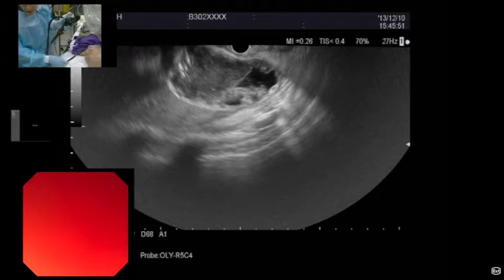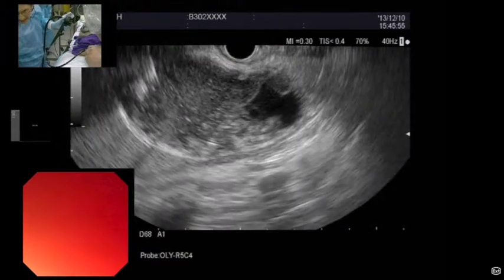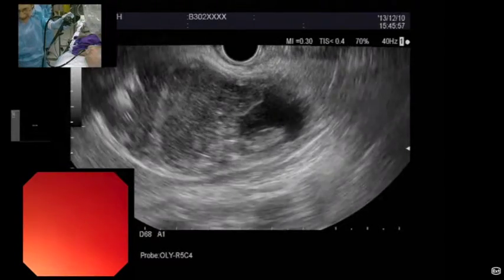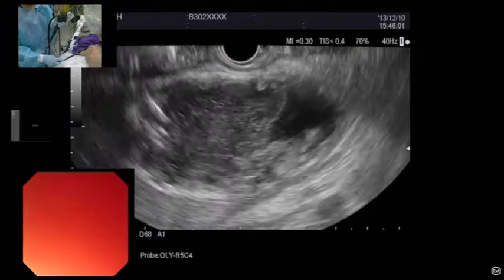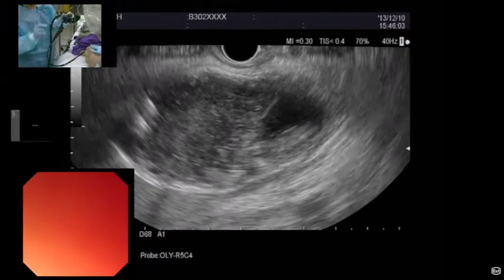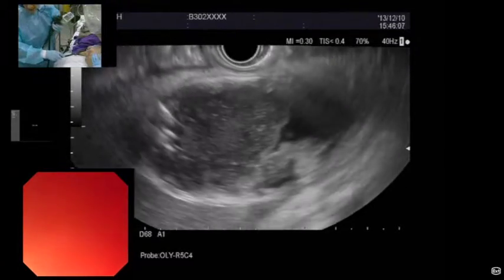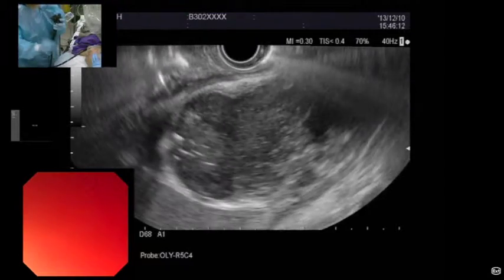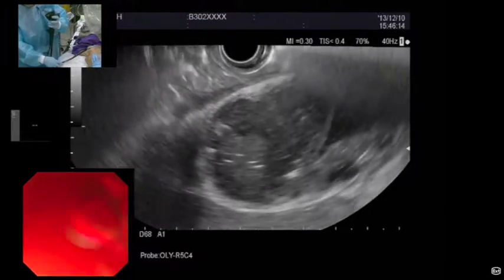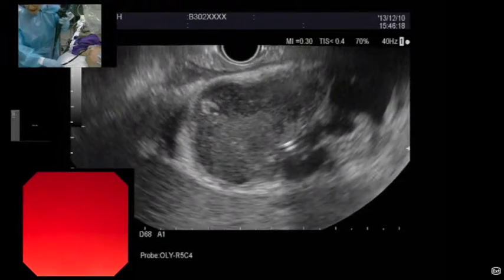There we go. So now I'm going to just enlarge the image a little bit. A lot of things inside the gallbladder. It's interesting. There's a lot of material inside of the gallbladder. And then I believe we also heard that he might have some stones in the gallbladder as well. I'm wondering if on the left side you can see some echogenic structures, some creating some shadowing.